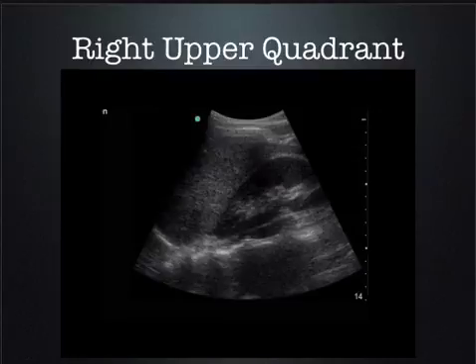But Morrison's pouch looks pretty clean. There's no blood in there. Does anybody see any blood in there? No, but you do see some up here. Watch when it plays. See, when that rib gets out of the way, there's a stripe of fluid up there. Remember, you have to look at the whole thing. That's why Jed or Dan or Ted or I can pick up smaller amounts of fluid, because we're looking at the whole picture. We're not focused in on one spot.